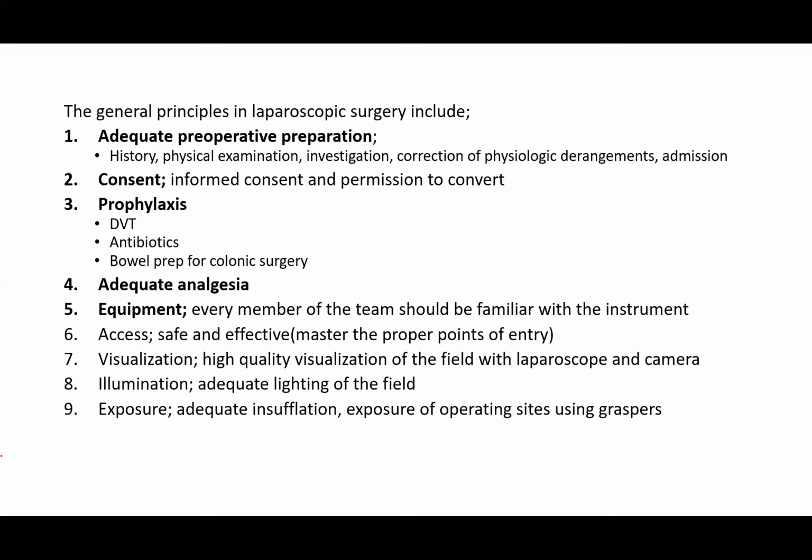Then there should be good illumination, adequate lighting of the field. The light source is connected to the telescope. In our next lecture, we'll discuss the classification of laparoscopic instruments, and this will make more sense and you will understand better.